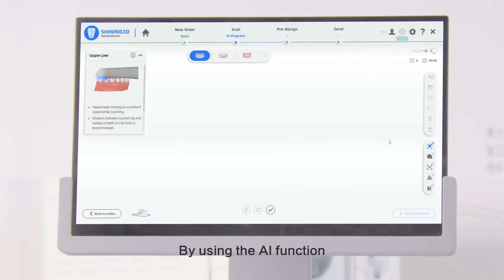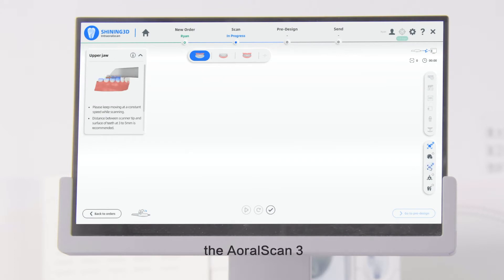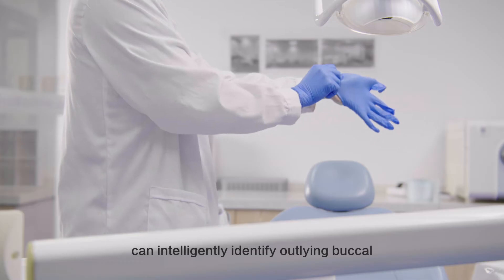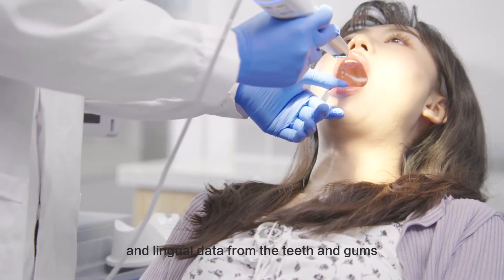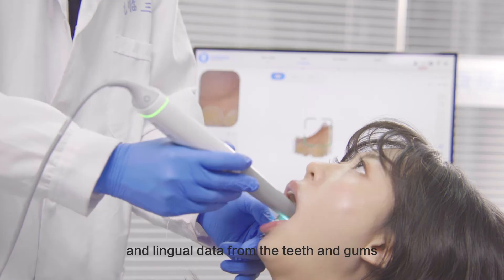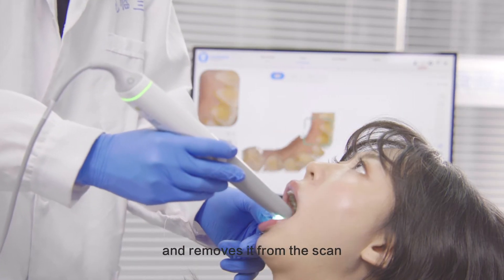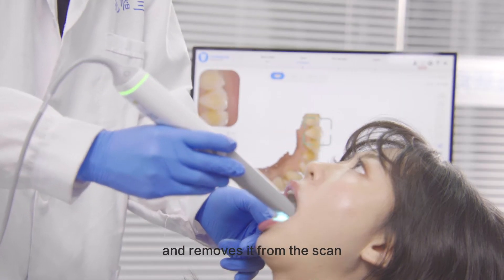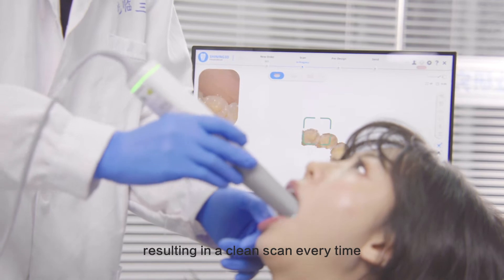By using the AI function, the OralScan3 can intelligently identify outlying buccal and lingual data from the teeth and gums and removes it from the scan, resulting in a clean scan every time.